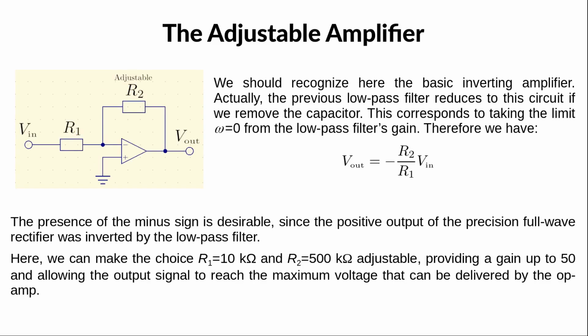We need to perform a final amplification which, this time, is adjustable. This is a basic inverting amplifier. We can directly obtain the output as a function of the input by noticing that the previous low-pass filter reduces to this circuit if we remove the capacitor. The gain is therefore obtained by taking the limit of the low-pass filter's gain when omega equals 0. Therefore, Vout equals minus R2 over R1 times Vin.